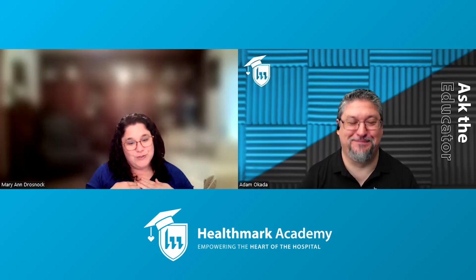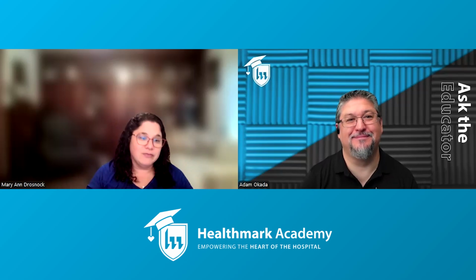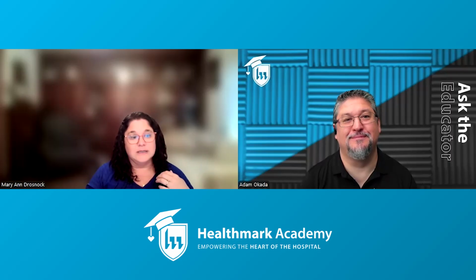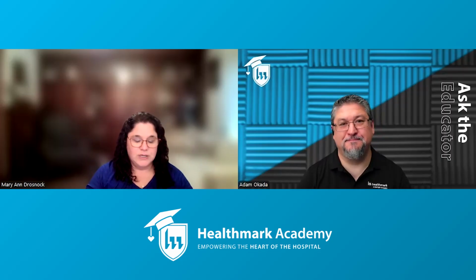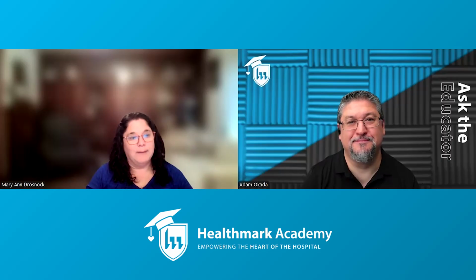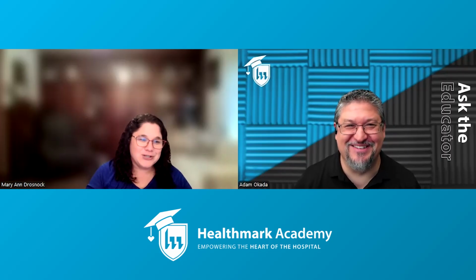These scopes are used in lungs, they're used in kidneys, they're used everywhere. And a piece of a scope falling apart in a lung is a lot more serious than it falling off in the GI tract. But we see brushes that are popping out of endoscopes into patients, brush heads or bristles. We see stents. I remember back in the day, I had a report of a popcorn kernel popping out of a scope into a patient. Clearly, that didn't come from the patient.